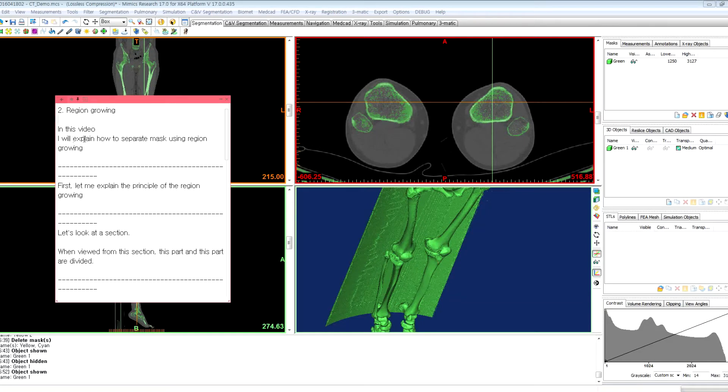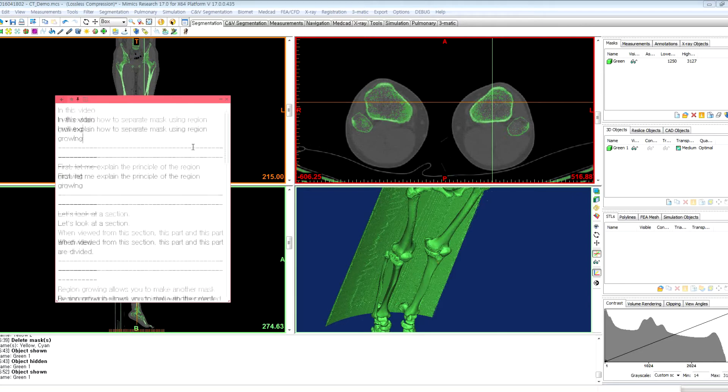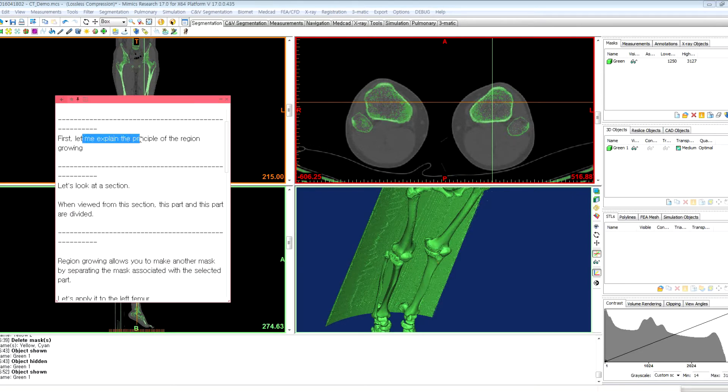Hello. In this video, I will explain how to separate masks using region growing. First, let me explain the principle of region growing.